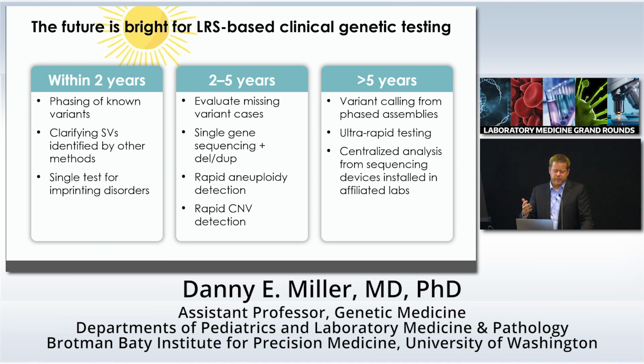And then you can start thinking of, maybe I put this in here, and maybe it's a little bit crazy, but that's fine. Say you install a device at a satellite location, you do that sequencing on the device, but you transfer that data back and you do the analysis yourself. This is the kind of technology I think that makes it easy, right?